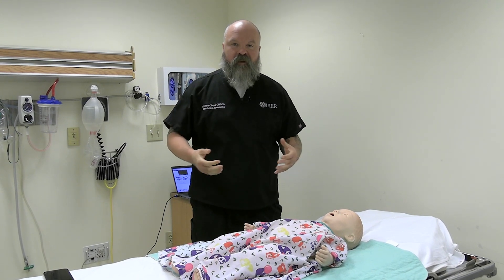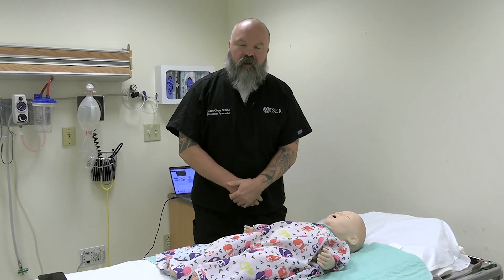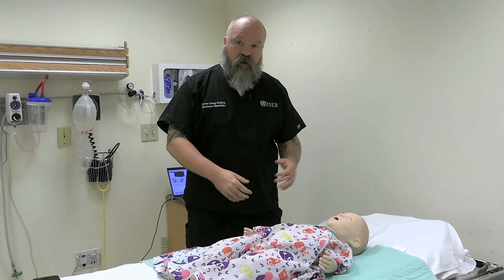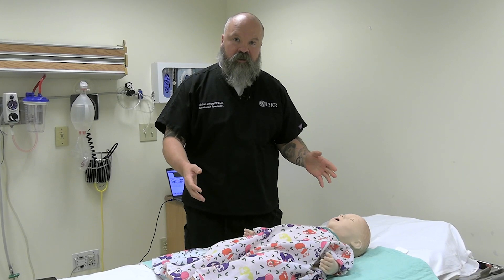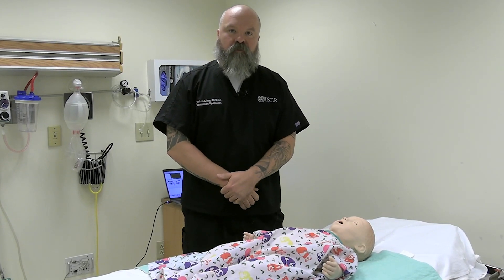Hello, welcome to Wiser. My name is Clinton. I'm a simulation specialist here and today we're going to talk about SimBaby. SimBaby is a high fidelity simulator made by Laerdal. Today we're going to go through all of its features and applications and show you all the fun things we can do with SimBaby, so that when you come into our center you're comfortable and ready to go.